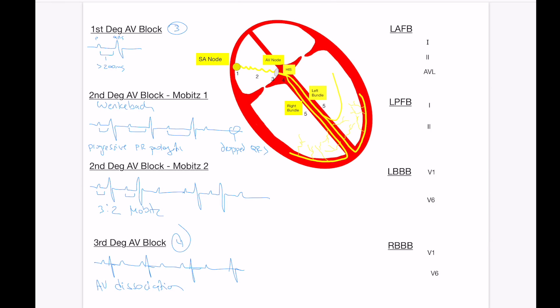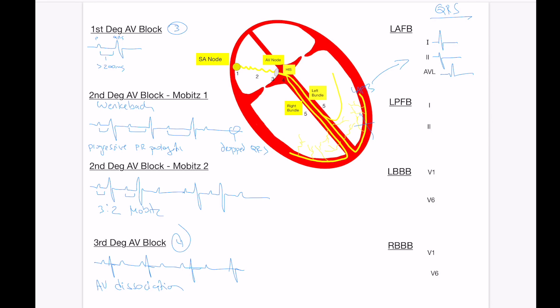Now, let's look at the bundle branches and the fascicles. These are going to be abnormalities of the QRS complex. You can get individual block in the fascicles. So if you have a block in the left anterior fascicle, what you're going to see is a positive deflection in lead one, you'll have a negative deflection in lead two, and often you'll have a mini Q wave in lead AVL. This negative lead two pushes the vector towards a left axis, and oftentimes the QRS duration is going to be between 100 and 120 milliseconds because there is some degree of conduction delay here.